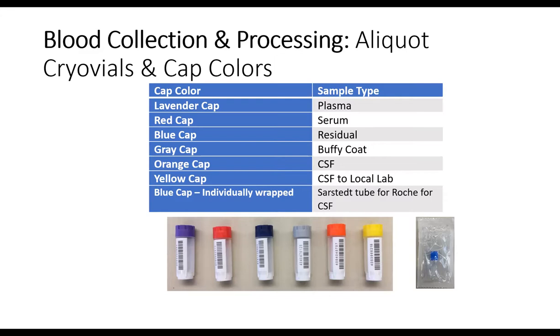There is an additional tube that we will collect CSF directly into, and it's a Sarstedt 2 ml tube that will be used for a Roche assay. And so we'll describe that a little bit here in the CSF collection section.